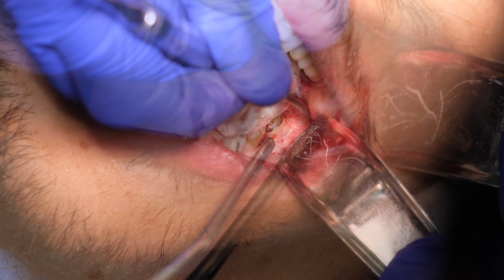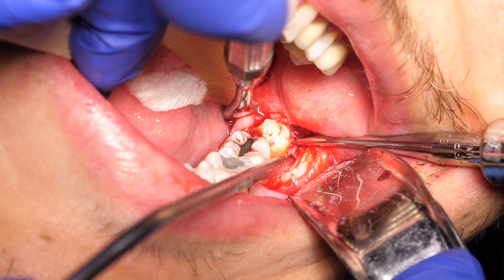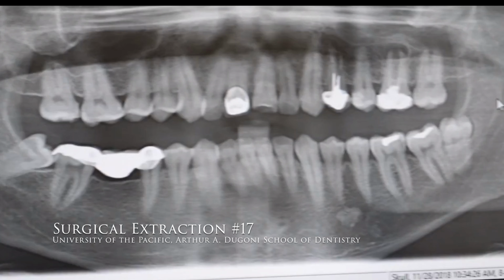I'm an assistant professor at the Oral and Maxillofacial Surgery Department at the University of the Pacific Arthur A. Dugoni School of Dentistry. Today we will present a surgical extraction case of number 17 done at the predoctoral clinic at University of the Pacific. Please be aware that this video is meant to supplement and not replace proper instructions and guidance when performing such a procedure.